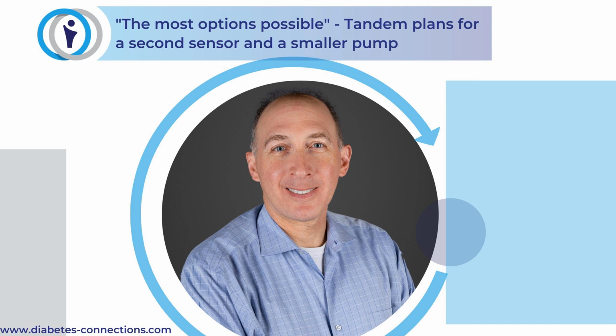And you are absolutely correct. It's fully phone controlled. You have a phone app, just like we have with our mobile app today, but in this case, it can run everything. The algorithm still runs on the pump itself, right? So you don't have to have your phone with you 24/7, but you control everything from your personal cell phone.